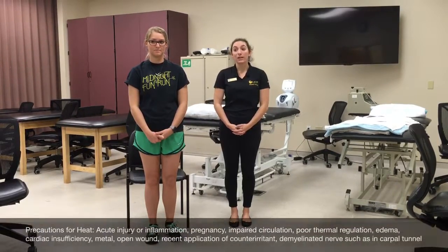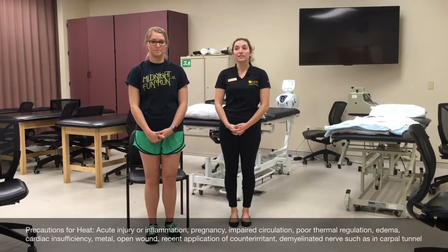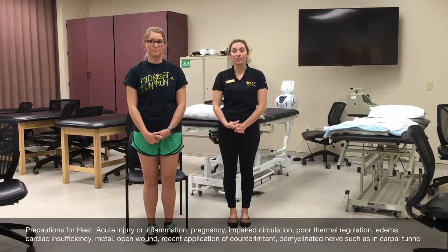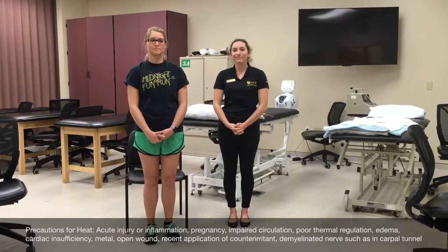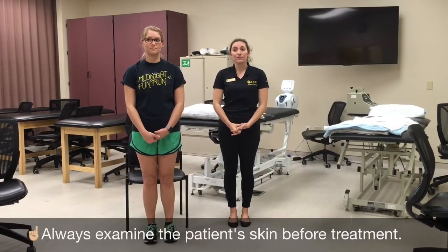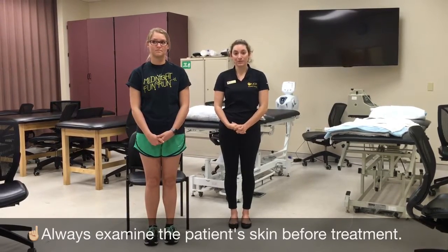Additional contraindications are listed below. Precautions include edema, cardiac insufficiency, metal in the area, or demyelinating conditions. Additional precautions are listed below. I will perform a sensory exam using light touch in the areas I'll be applying heat. I will check skin integrity for wounds as well.